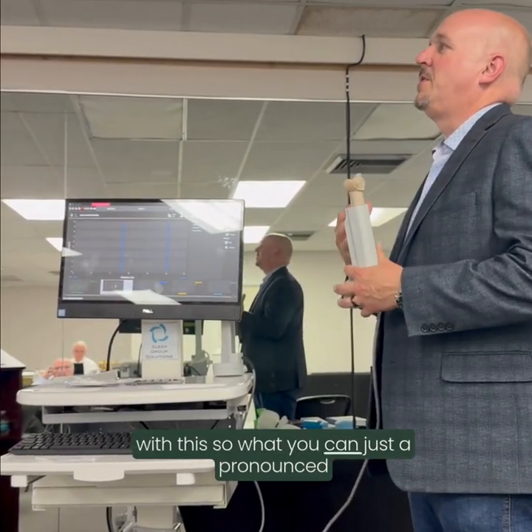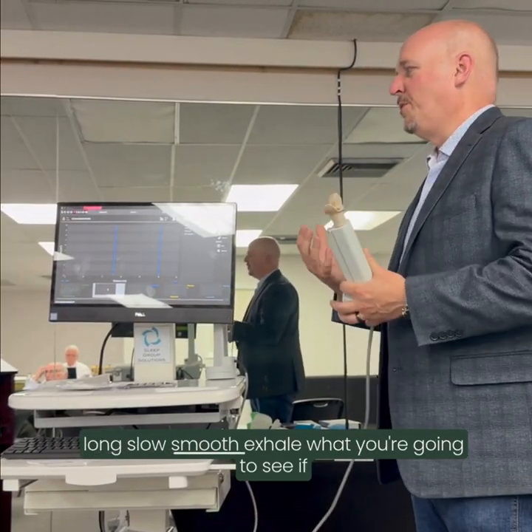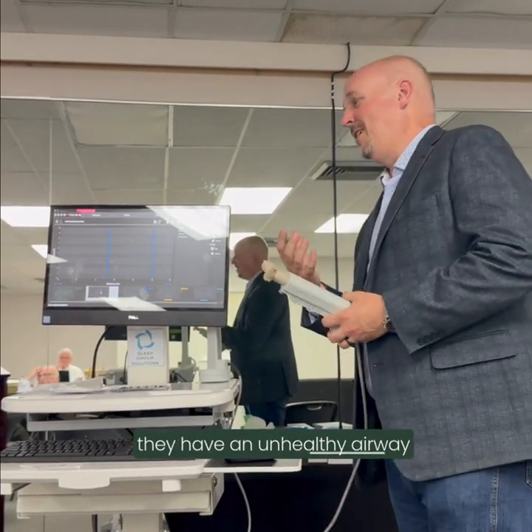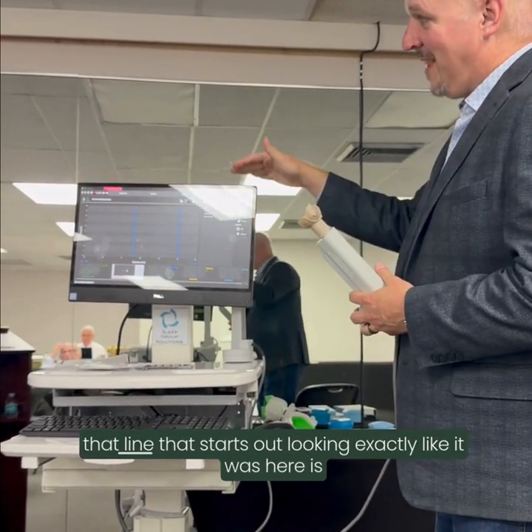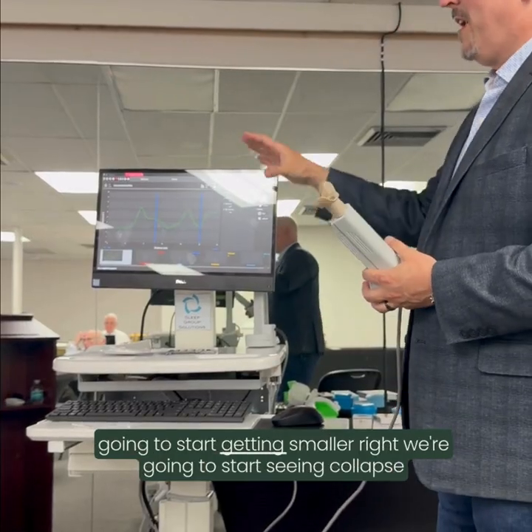So what you want them to do is just a pronounced, long, slow, smooth exhale. And what you're going to see, if they have an unhealthy airway, if they have an airway that has propensity and ability to collapse, is that the line that starts out looking exactly like it was here is going to start getting smaller, right?